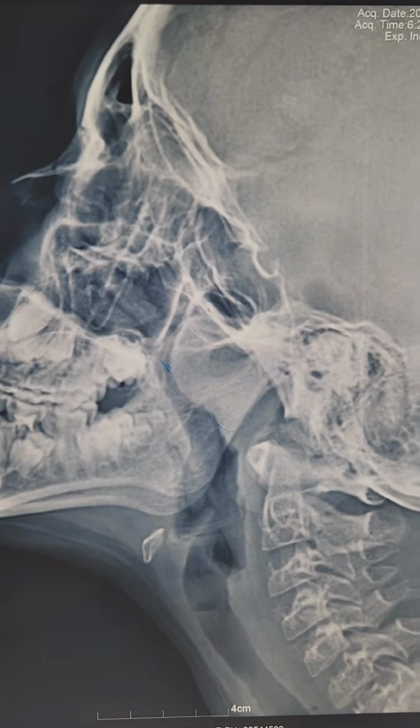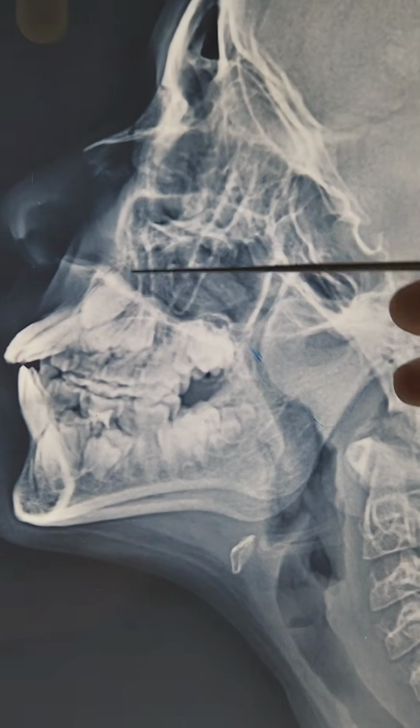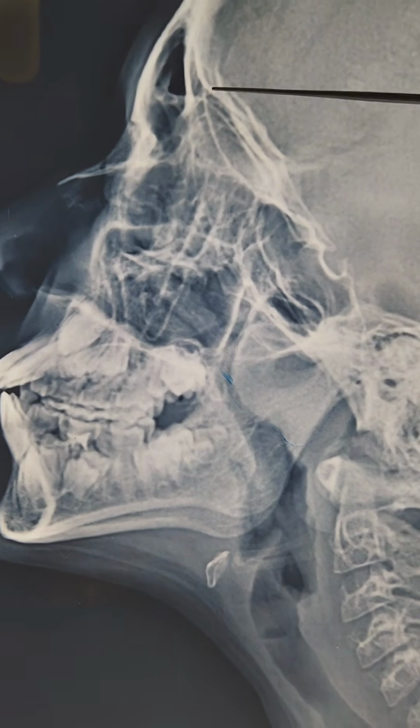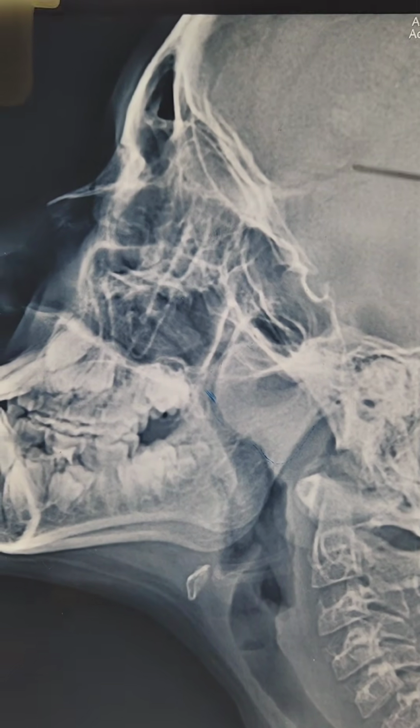Now, the same thing I'm going to show you on the X-ray nasopharynx here. So that is the patient's lateral view, and that's the nose, and that's the nasal bone up there for your orientation. That's the entire nasal and the sinus area. That's the skull base, and that's the pituitary gland, and that's the brain above.